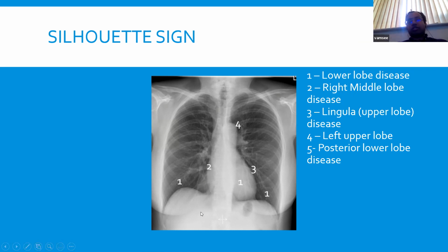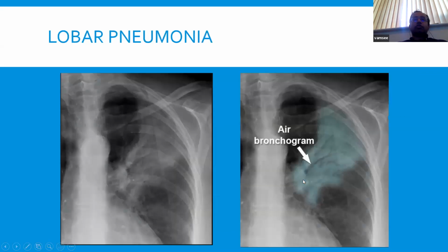But otherwise, generally stick to zones. And again, if you're not sure, stick to zones. Yep, so that's basically that. There's not much to say.